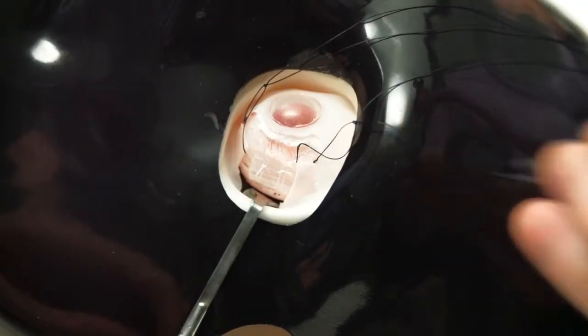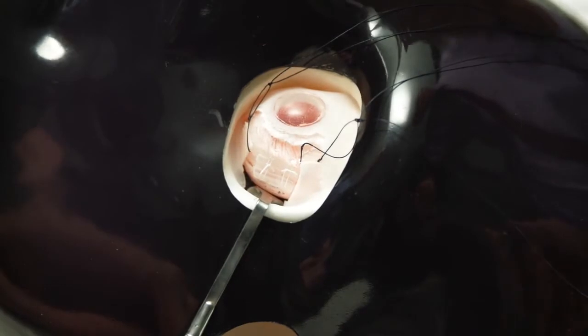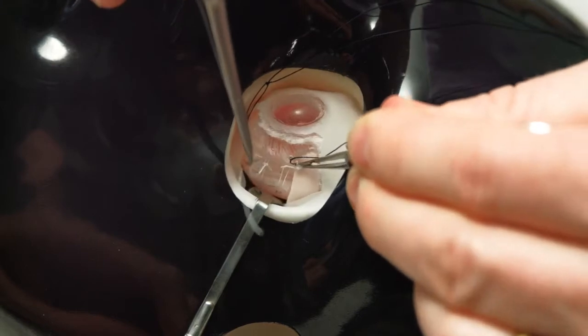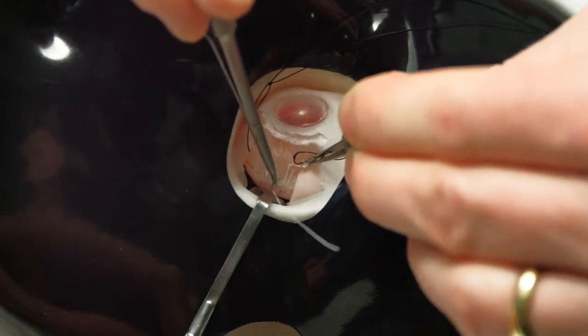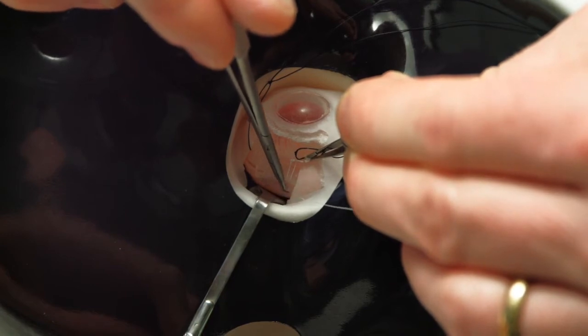The needle drain is performed with a 5-O-ethibond needle. About a third of the needle is outside of the needle holder, and that third is then introduced through the sclera in one movement.